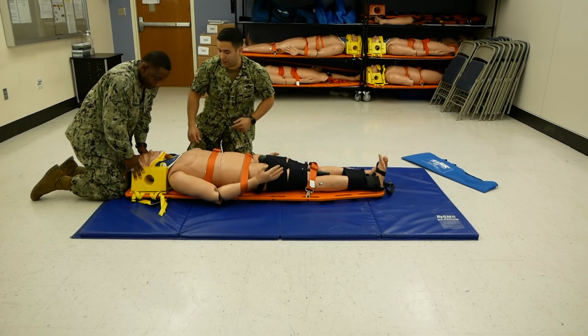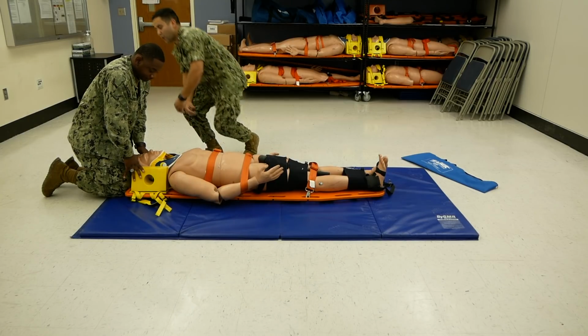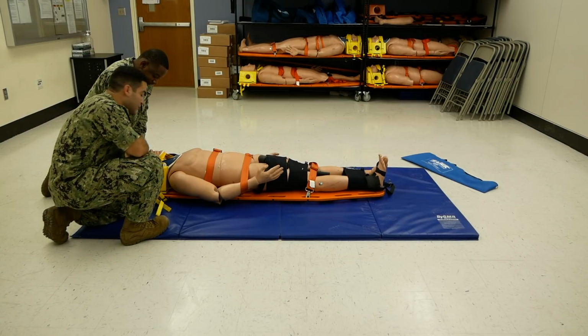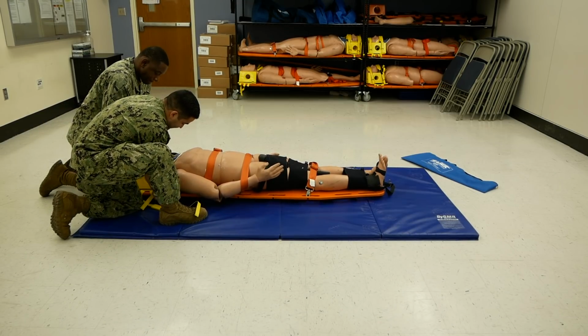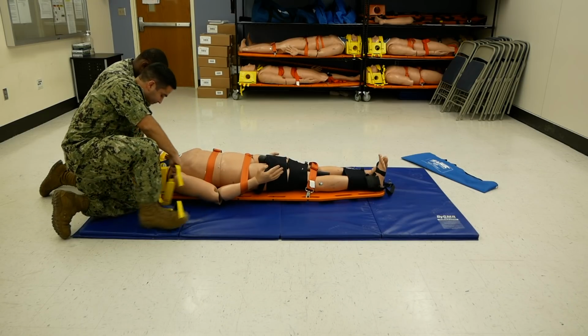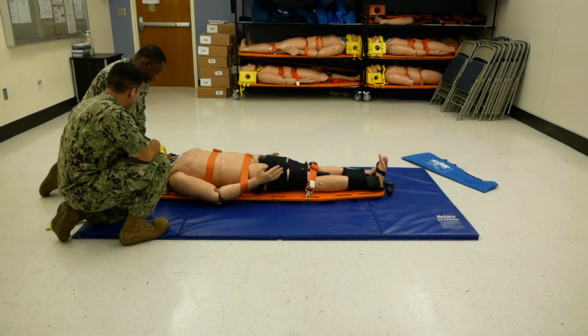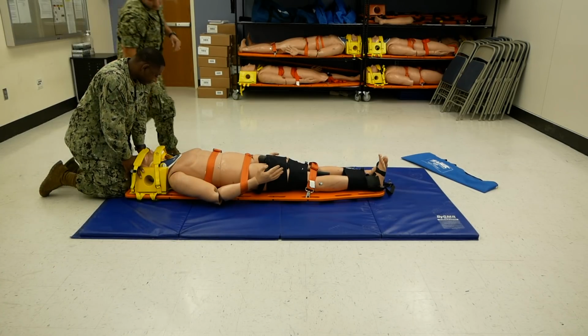And now continue to strap the patient in. As you can see, the straps are underneath the board. What you want to do is as little movement as possible. Go ahead and lift up. Lift the patient up slightly, just to get the strap out. Apply the chin strap.